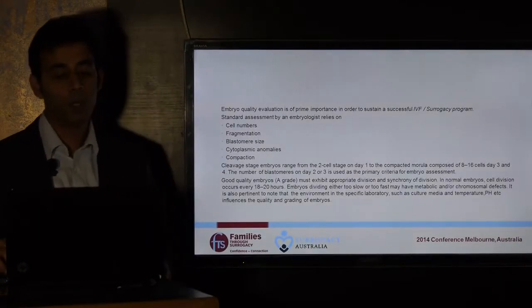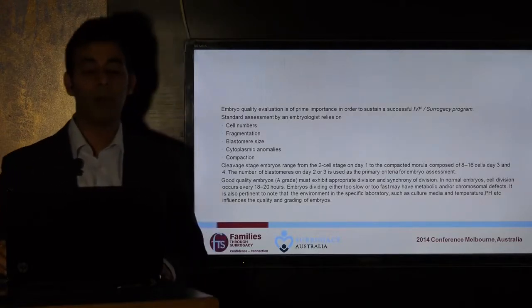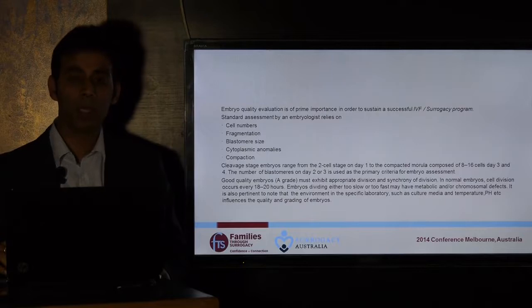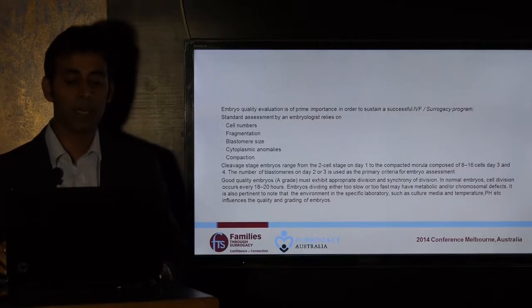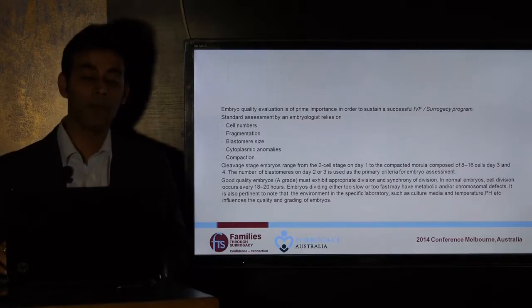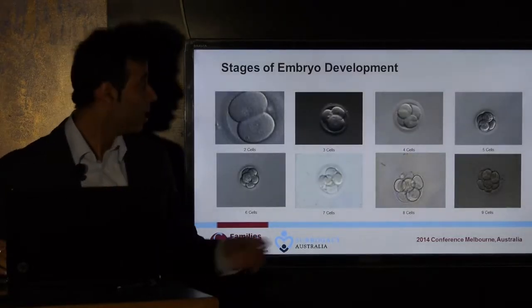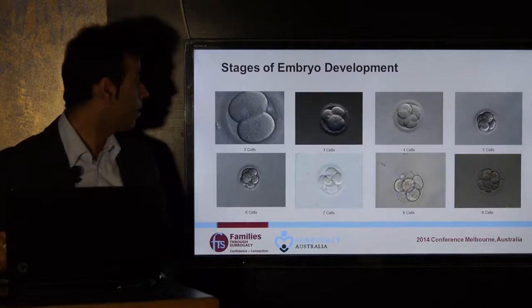It is pertinent to note that the environment in the IVF laboratory should be as ideal as possible, so that the culture media, temperature, pH, etc. have a positive influence on the quality and grading of embryos. Now here are the various stages of embryo development.